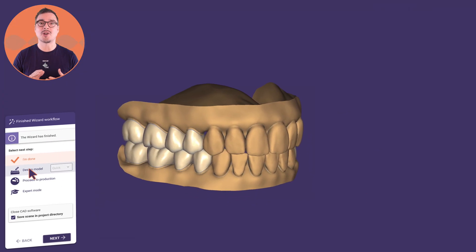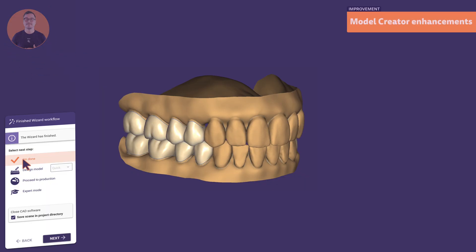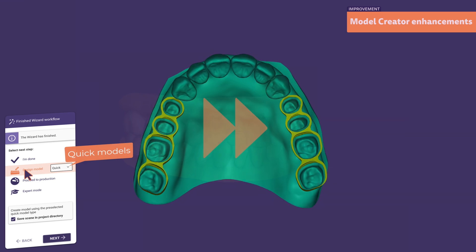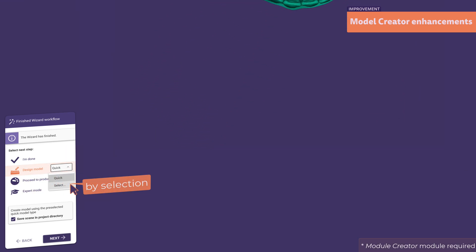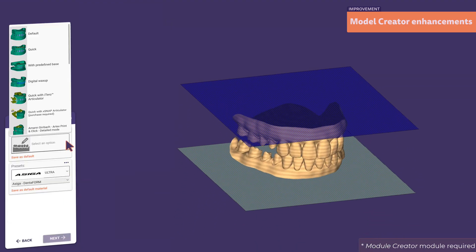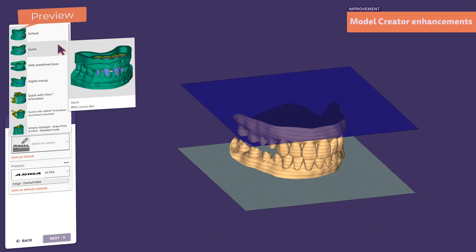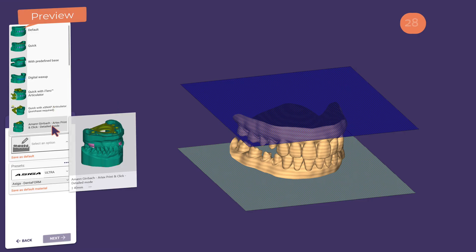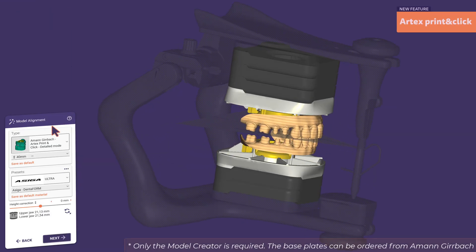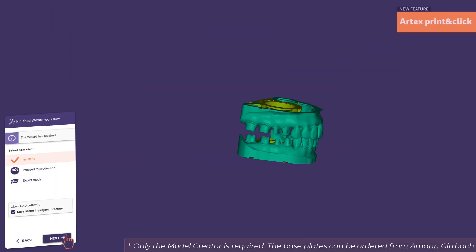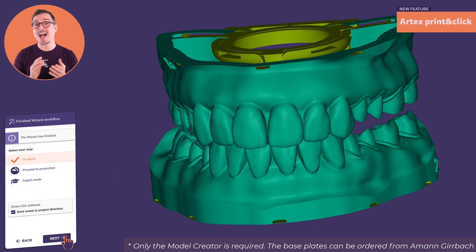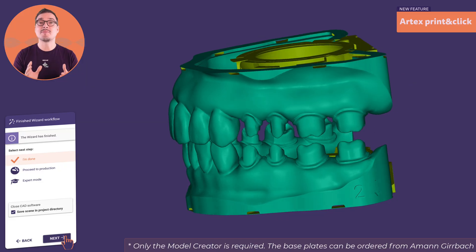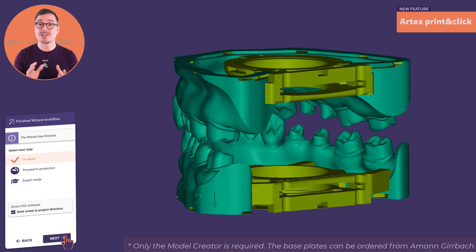In the model creator module, the quick model design can be started much faster from the last wizard step, making it a one-click workflow. You can quickly preview and assess different model types and choose the type you need, like the brand new Artex print-and-click. By adding this attachment, you don't need plaster — the models simply click into your Artex articulator.